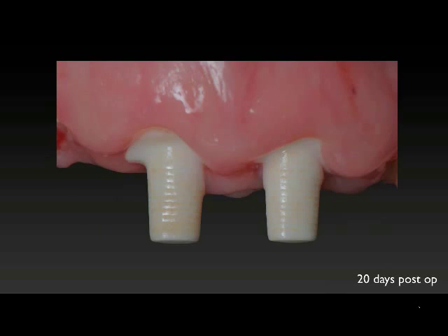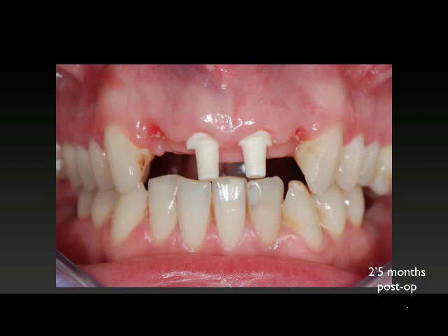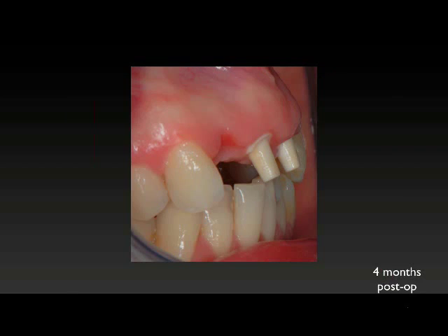This is a close-up view of the tissue as it's healing, and the surface of the implant is starting to collect a little bit of plaque. An occlusal view of the healing — we're waiting for the tissues to fully mature. The angulation, without issue, you can see with a more distal implant against that canine, we have more than enough space for our restorative materials.